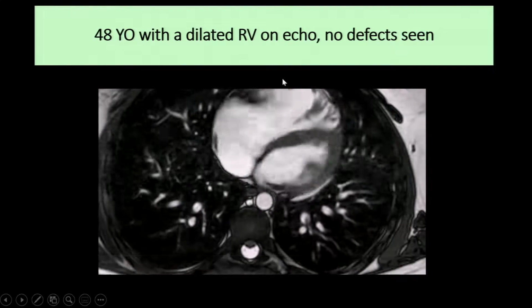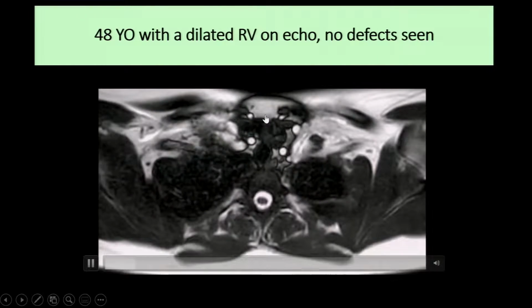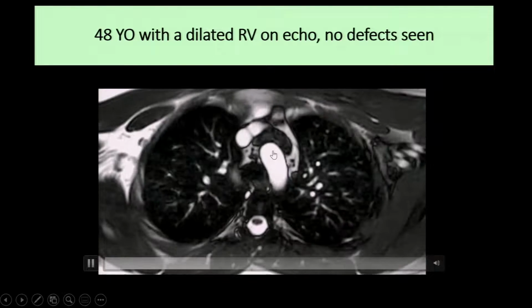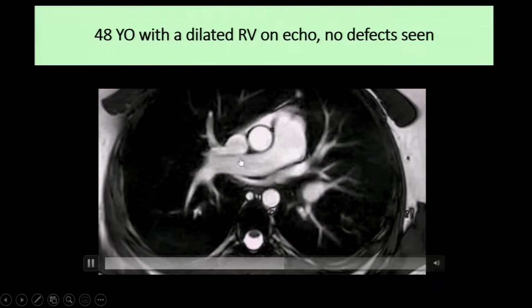You can see we're looking again at the coronary, the IVC looks intact here. Again, superior, anterior, posterior, vertebral bodies here, your lungs here, aortic arch, innominate. Here, this is the SVC. We see the azygos coming in. We follow it down.